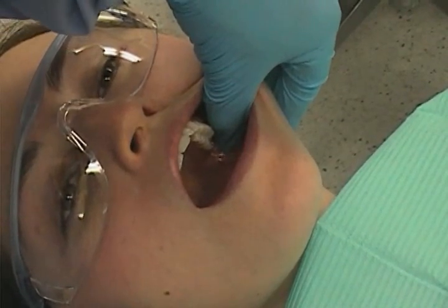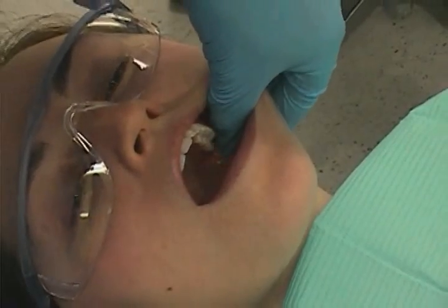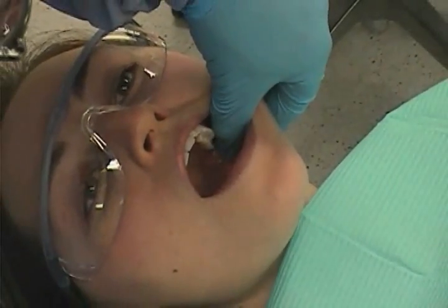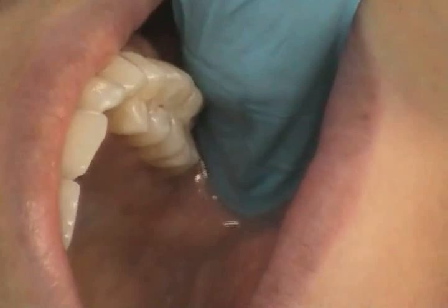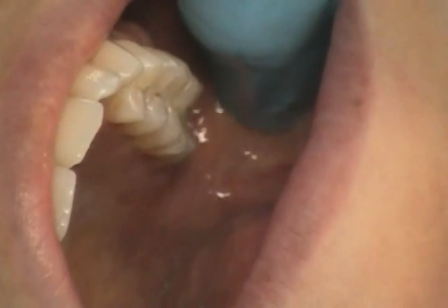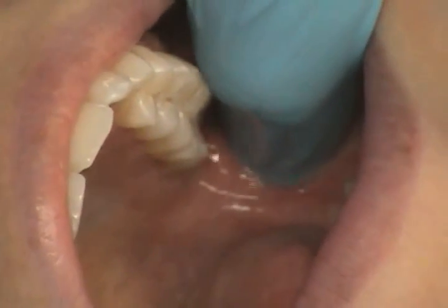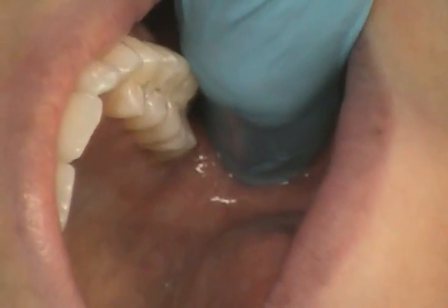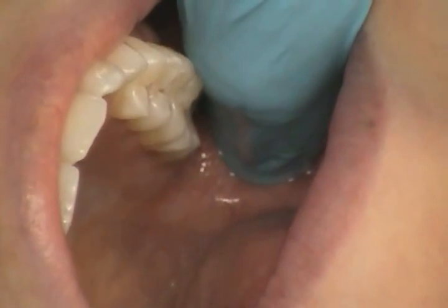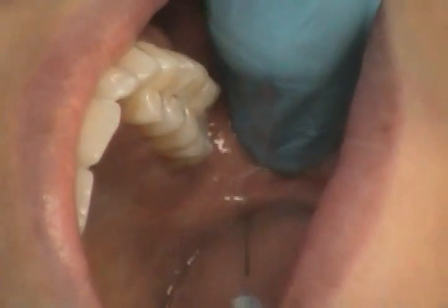Your landmarks will be the coronoid notch — the greatest concavity on the anterior border of the ramus — the pterygomandibular raphe, and the occlusal plane of the mandibular posterior teeth. For the syringe position, we would place the syringe barrel at the corner of the mouth, usually over the bicuspids.